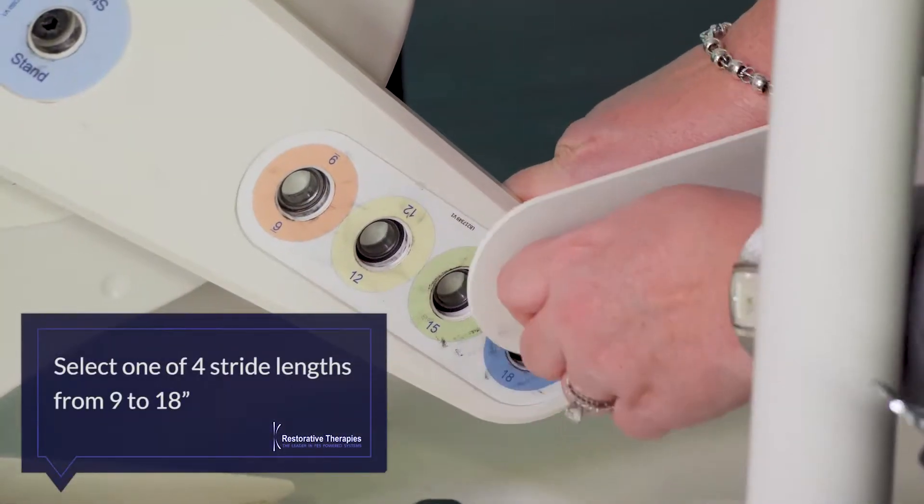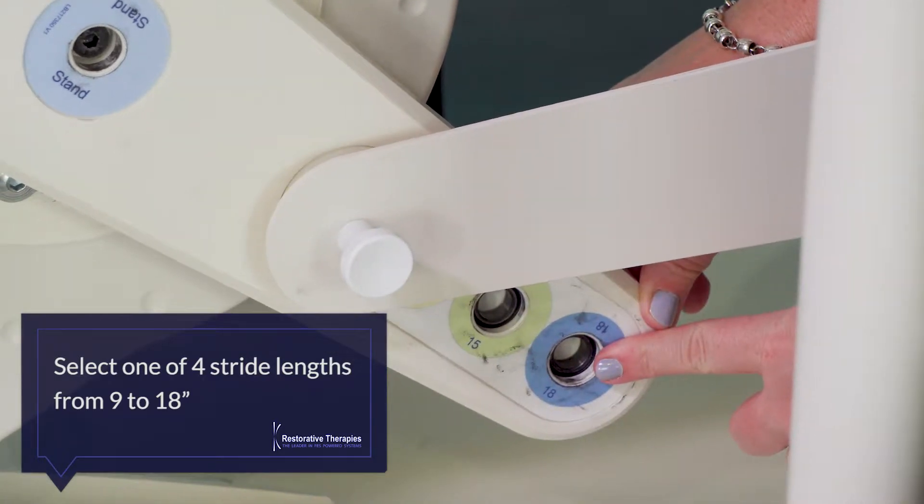I can select one of four stride lengths for Parker here, from 9 to 18 inches.